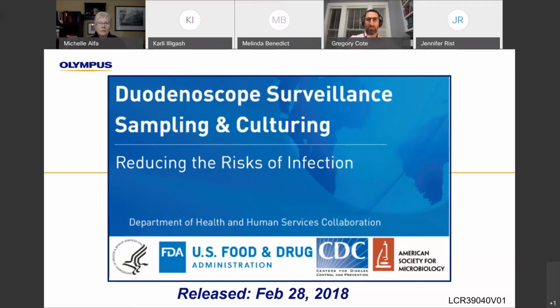There are not. I think this is really the conundrum that clinical practices and hospitals are facing: as Michelle said, there's really no surrogate for the culturing process to detect organisms on a scope after it has been disinfected. So really, as I see it, a culturing program in your facility is a quality check on your process, so that you can confirm that you're doing a good job reprocessing your equipment.